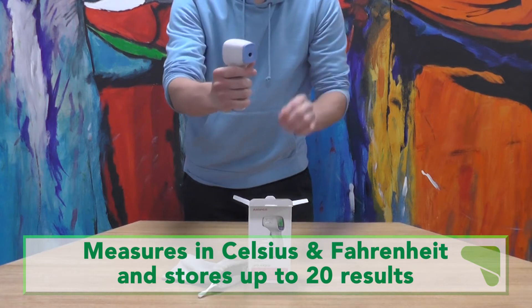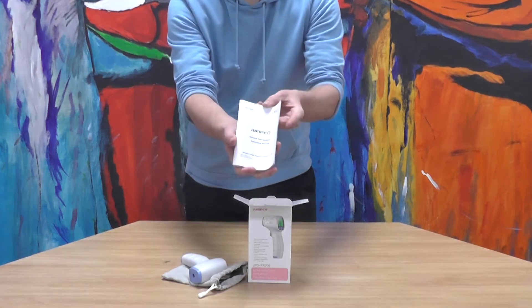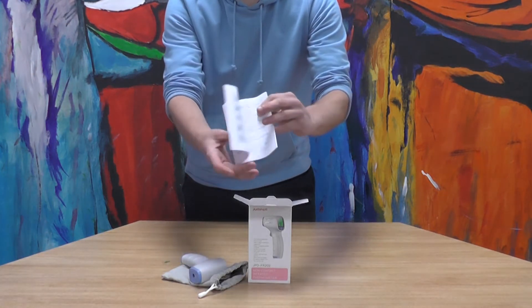The ergonomic handle is secure and fits snugly into your hands, allowing you to easily measure one person at a time, and the thermometer comes with a set of instructions.